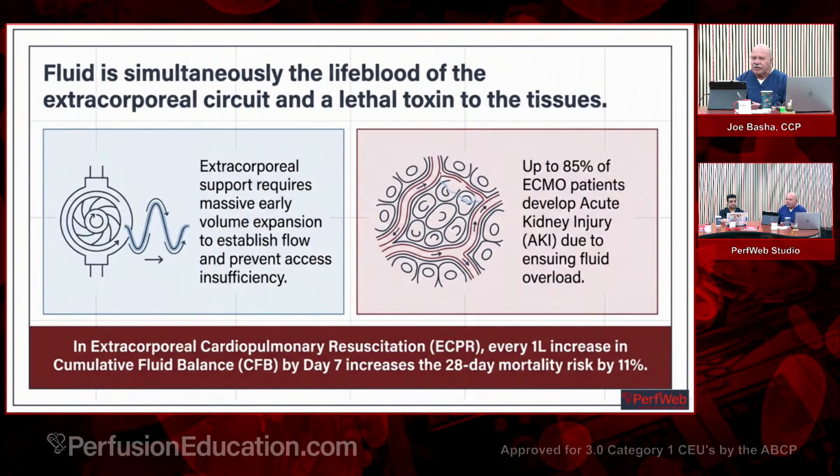We probably should more quickly say, give me some blood, check some blood quick. We should be saying that on our way into the hospital: we're going to be putting this patient on VA ECMO in the cath lab, get 2 units of packed cells and have them in the room, please. So at least we have that to get started with if we need it. If we don't, fine. You can always send it back to the blood bank.